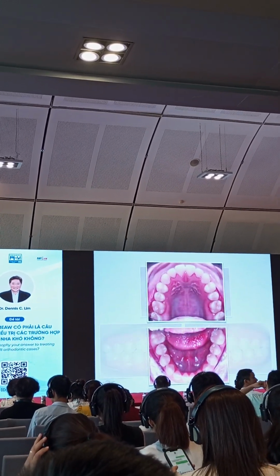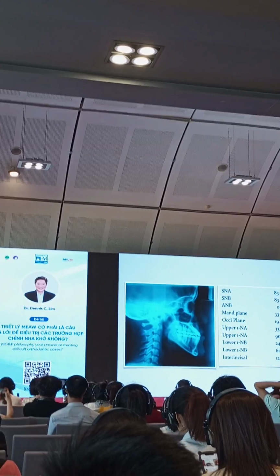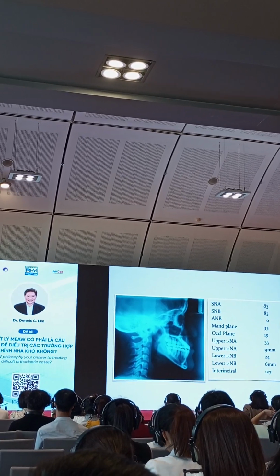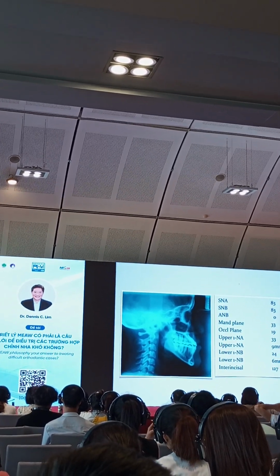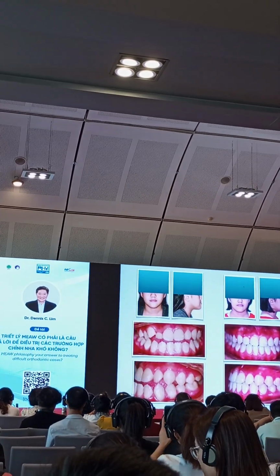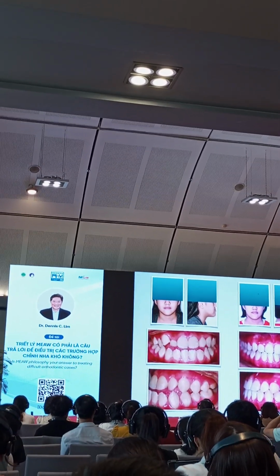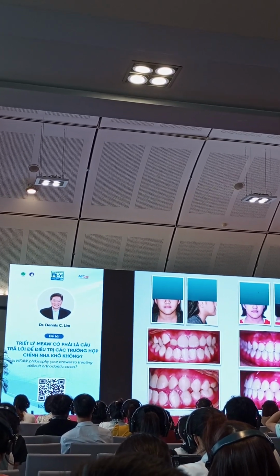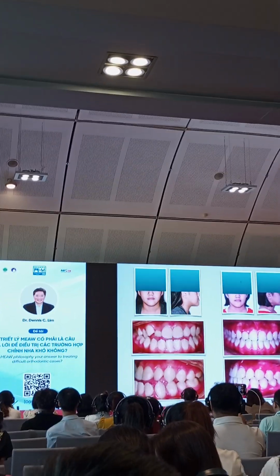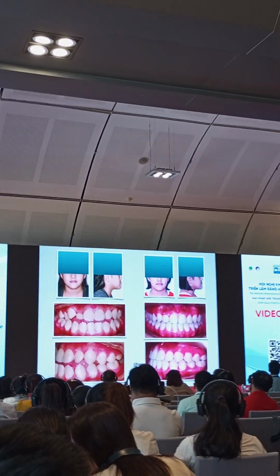So this is the occlusal view. And the cephalometric radiograph: because we did not do extraction, the incisors are still a little bit flared, but it is reduced. If you compare the before and the after, I'm sorry, the nose was cut off in the picture, you can see an improvement in the profile of the patient. There's a reduction of the mandible, going backward, and good interdigitation of the canine molar relationship.